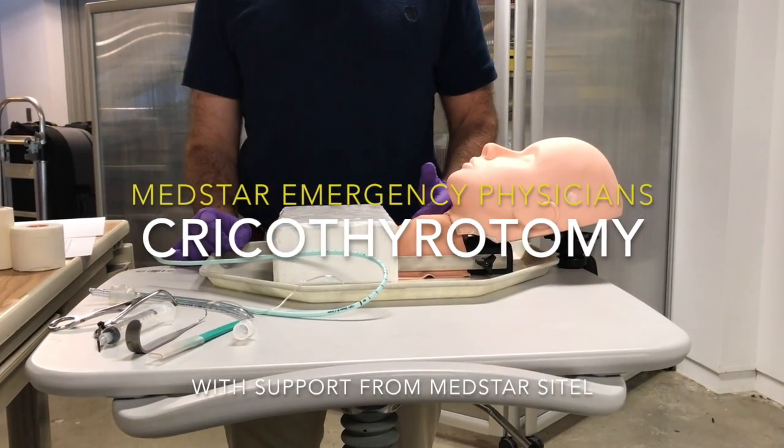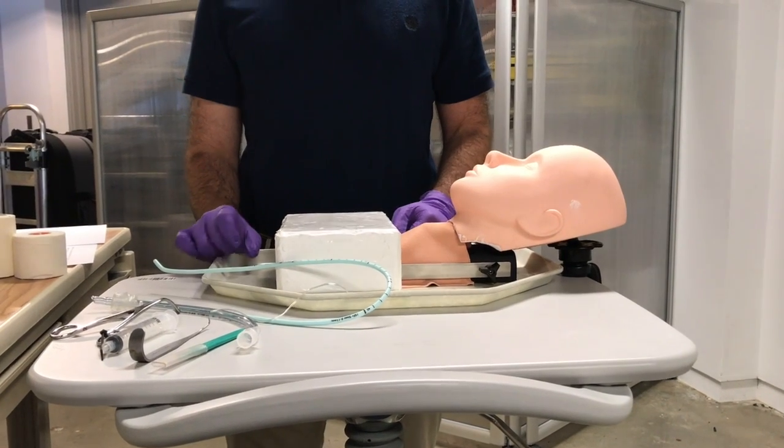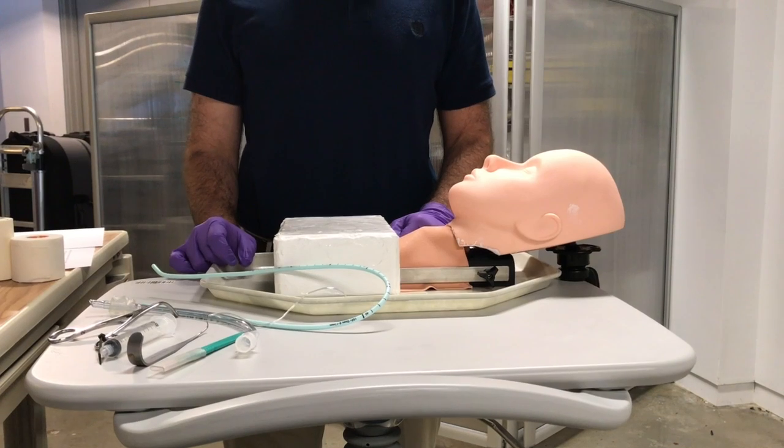There are three different ways to perform a surgical cricothyroidomy. The first is the classical cricothyroidomy, the second is the rapid four-step cricothyroidomy, and the third is the bougie-assisted cricothyroidomy.